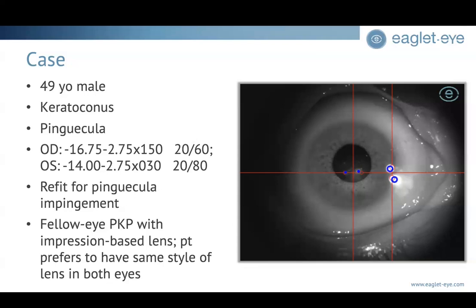And so I will use impressions and scans to compare data and make sure that we're not running into any poor data and look at the big picture using those two different styles, especially with patients that travel from out of town. We'll do both. And so in this case, we brought the patient in to get an impression done, and redid his right eye.